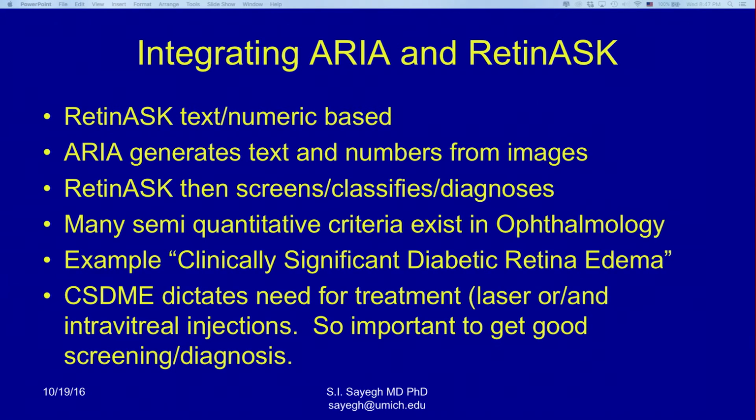Okay, so I'll just wrap up by saying that what we are in the process of doing is to integrate this area of automated diagnosis, pulling from the images, into the database system that we had already developed. And of course, it needs further development as we make this fusion or this interface, and also as we have more imaging modalities that become available to us.